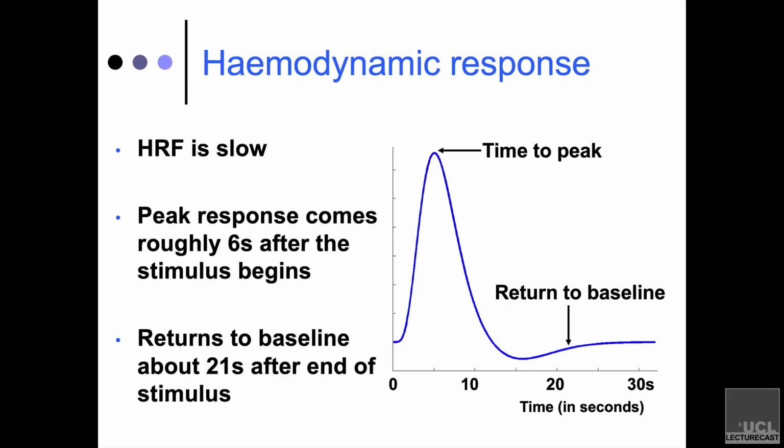One of the consequences of this is that the signal that we're measuring, the BOLD signal, is slow because it depends on your blood. So despite the fact that your brain cells are reacting on a millisecond by millisecond level, or maybe it's tens of milliseconds if you think that's a slightly more appropriate level, the blood flow doesn't respond that quickly.